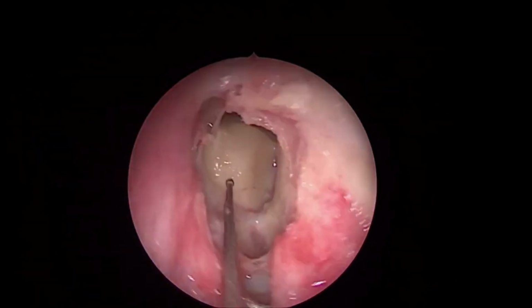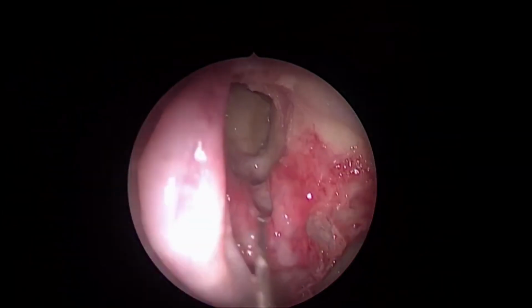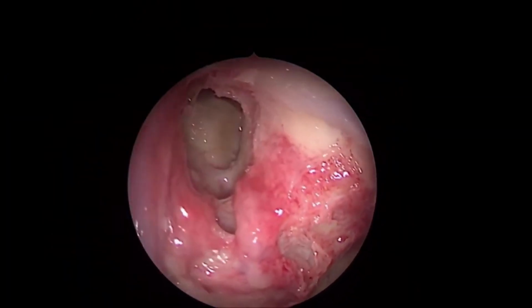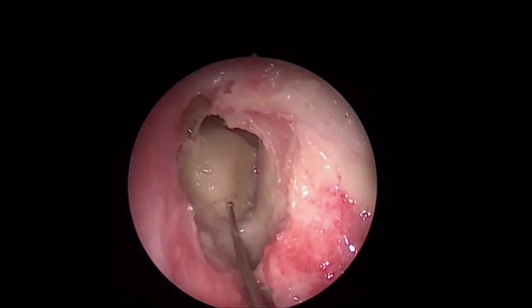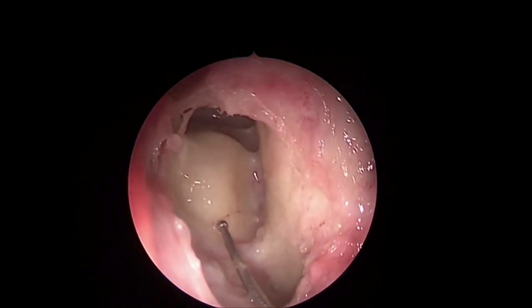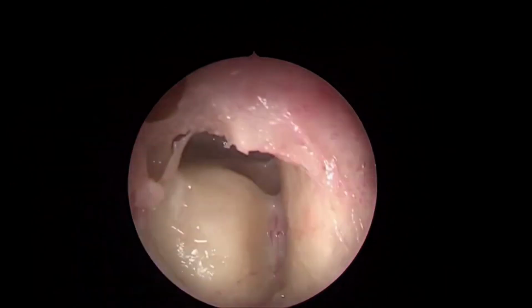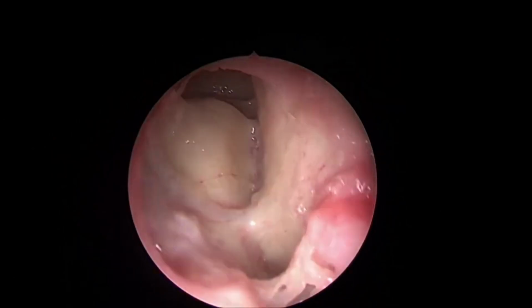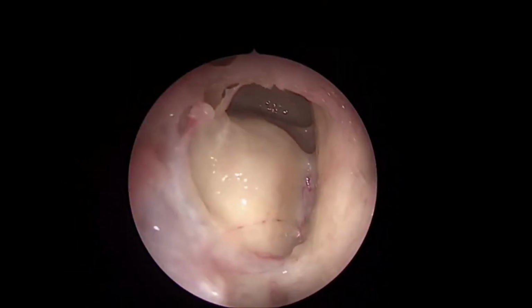Coming to Prakash Mukha sir's question, that is very, very valid. Why did we keep the bulla intact? See, our bulla is intact here. The reason is, we expect this bulla, when reaching the skull base on pre-op radiology, and we keep it intact so it automatically protects our anterior ethmoidal artery. So, sir, can you show us the landmark now for the anterior ethmoidal artery? Yeah, you can see the artery itself there now. It is uncovered. I told you, once this bulla is not reaching the skull base, this can be dangerous sometimes if you are not aware of it.